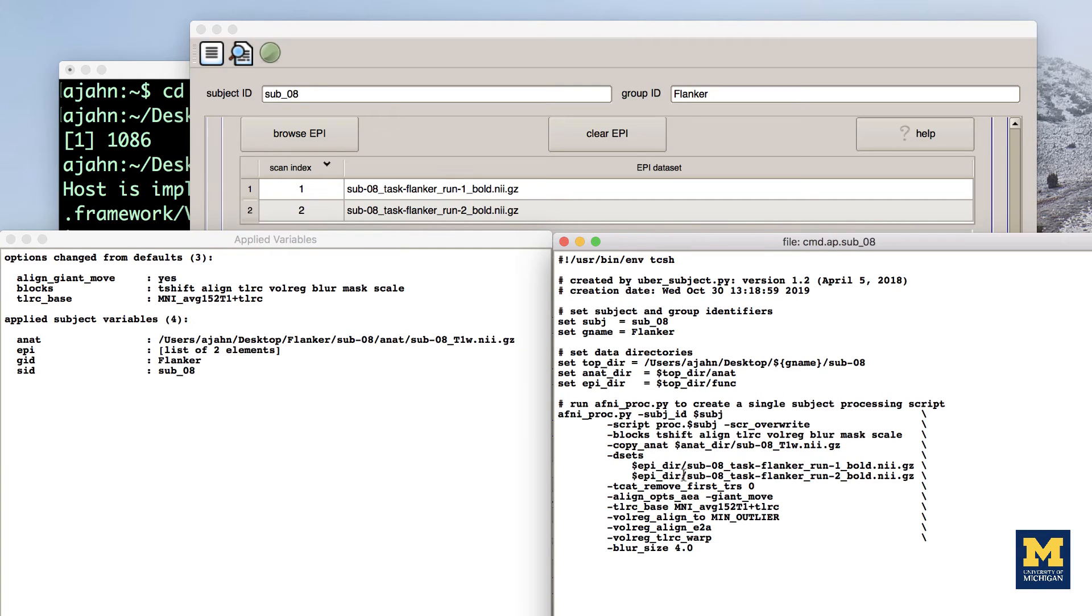Take a look at it to see how the commands and options listed in the AFNI PROC PY command correspond to the options you entered into the Ubersubject PY GUI. When you have finished looking over the output windows, close them.